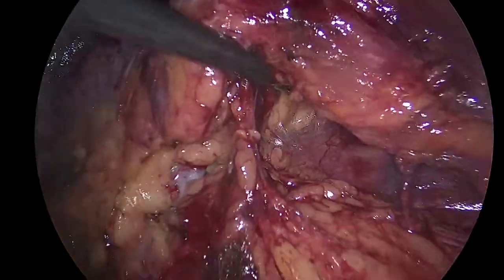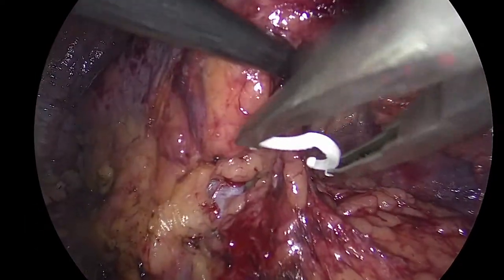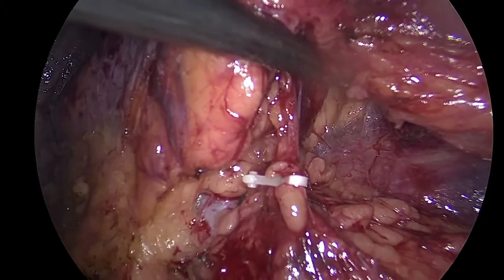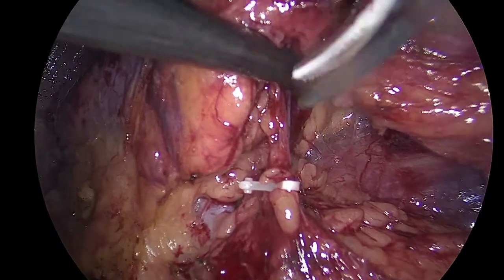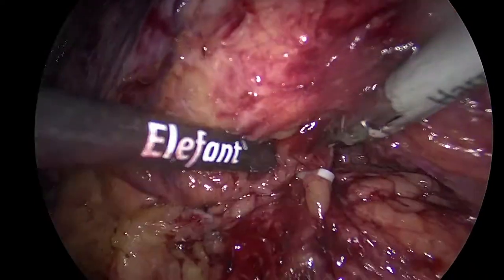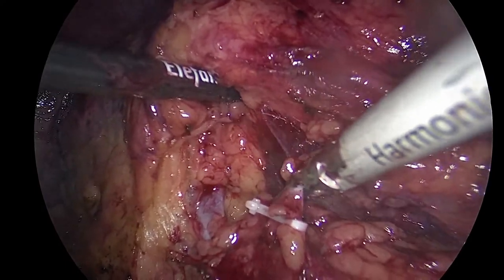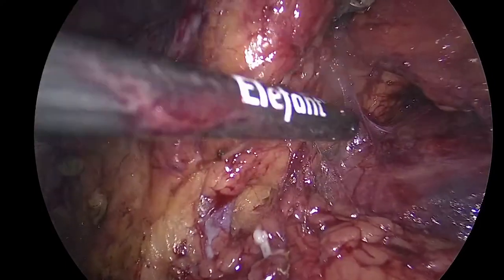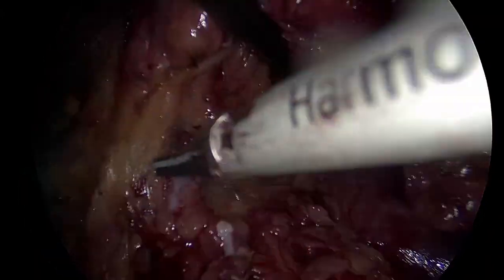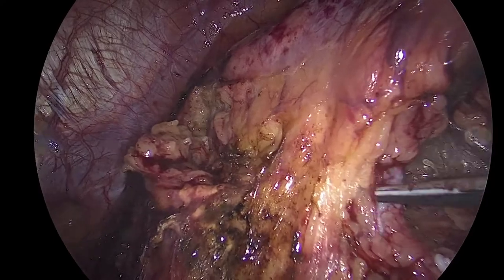Give me a clip. I normally take this with a ligature when I do a nephrectomy, so we don't need to put a clip, but just in case. Okay, give me harmonic. Normally the harmonic also should be able to ligate. We will see. Not more than 5 millimeters, no? We will see. It seems that it did its job, huh? Good. Show me. So we have adrenal here. You see how important the mobilization of the upper pole is? It's absolutely very important.